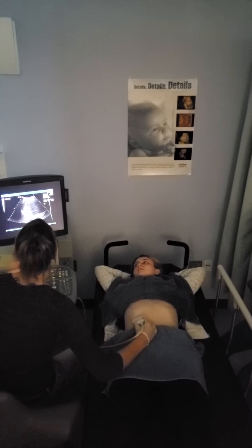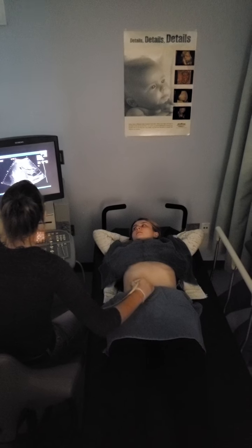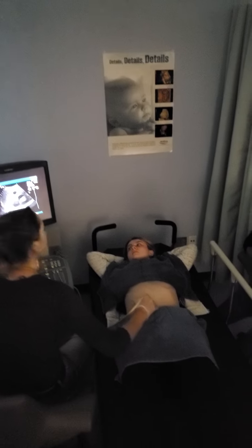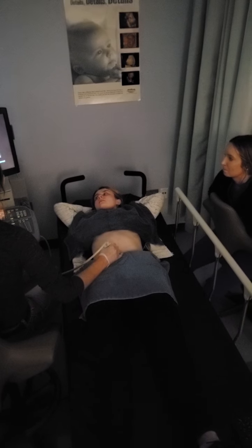All right, go ahead and big breath in a little bit. All right, so we came to our transverse. We've got our dome coming into hepatic land, coming into portal land. He's gonna be important in a second. And then finally coming into that kidney land. So those are our basic liver images, right? Good to go? So now we're going to do an MPV.